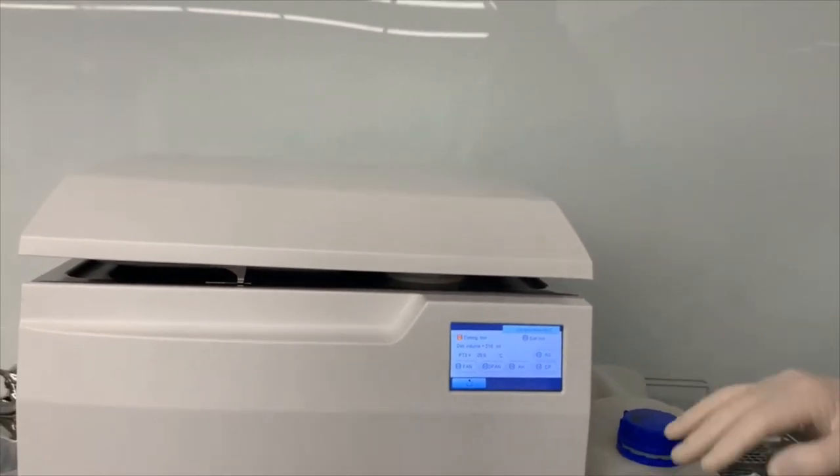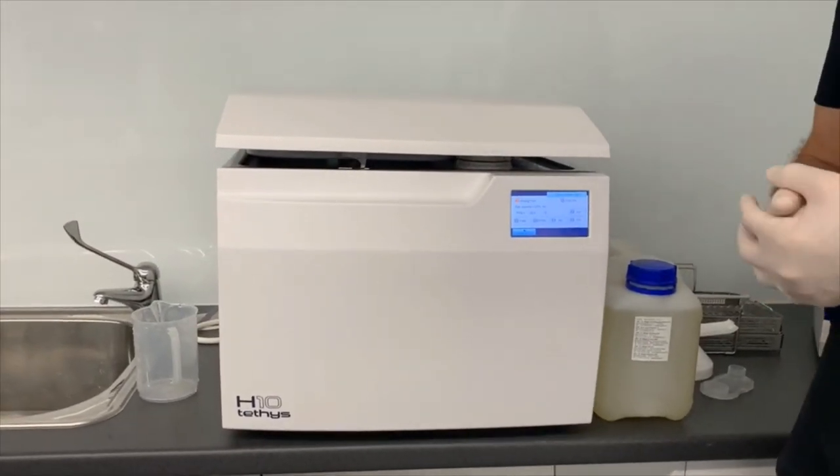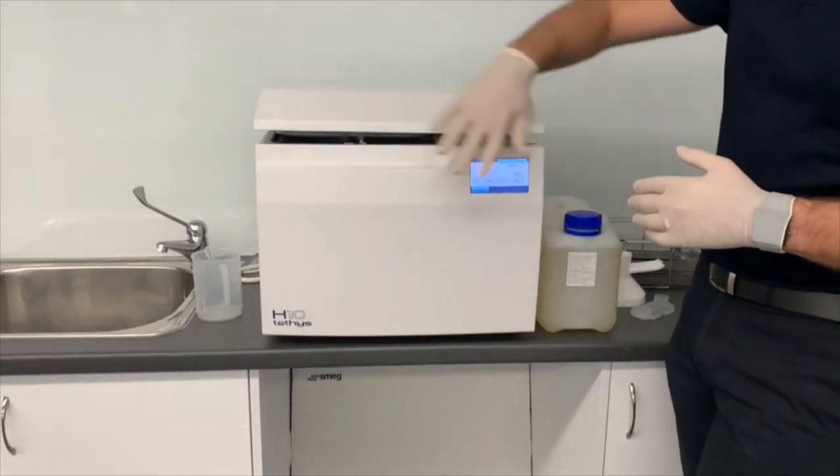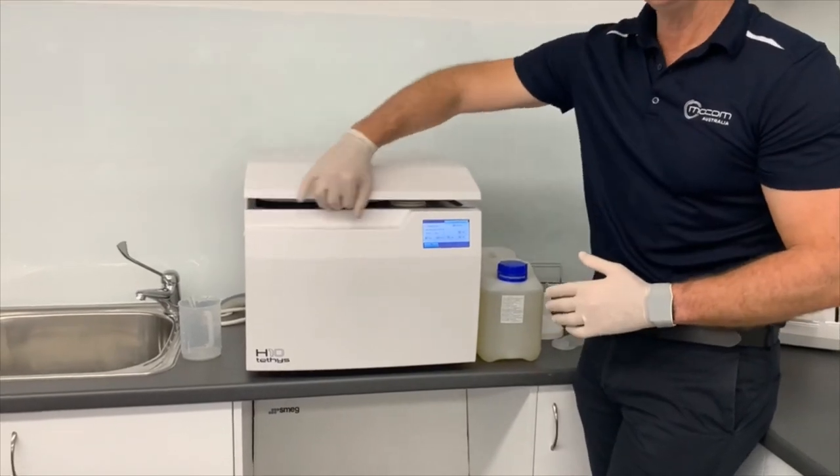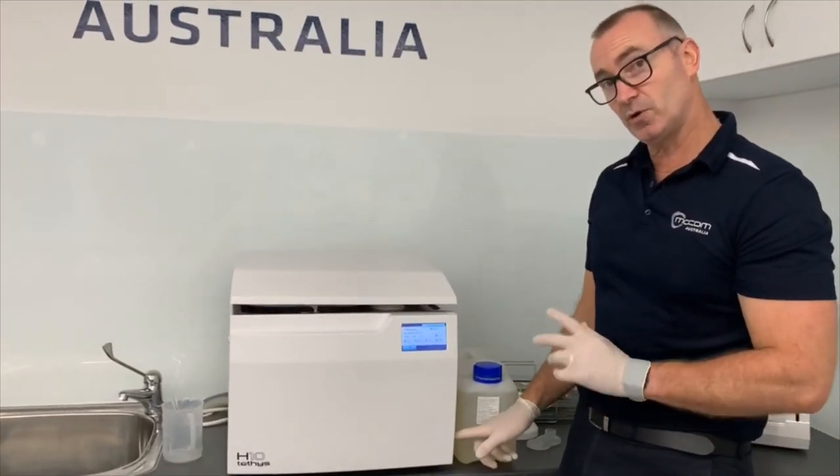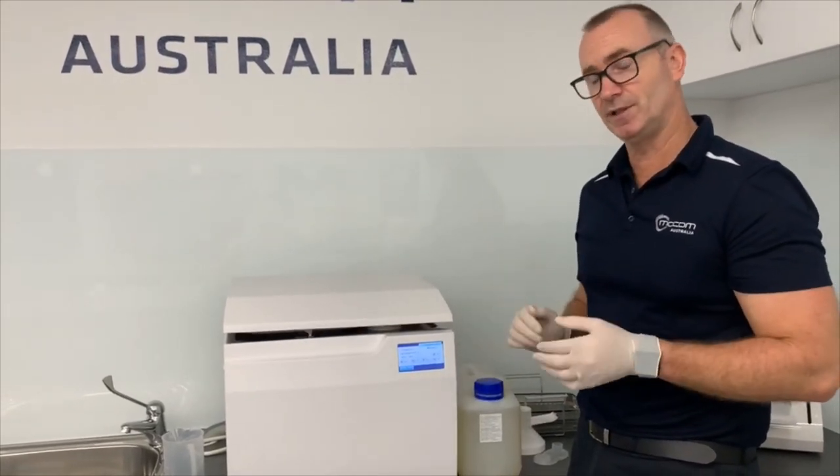After that, you would give the unit a good wipe down with a disinfectant. We use an alcohol-based wipe on all of the high traffic areas. So the touch screen, the front of the unit, the lid, the under lip of the lid, the recess for the stop, the on-off button. So we're sanitising the outside of the unit.